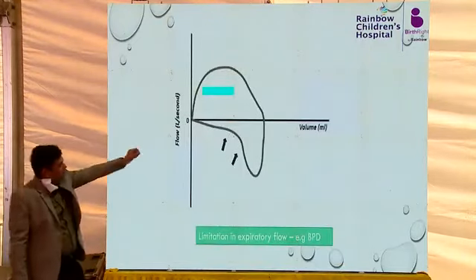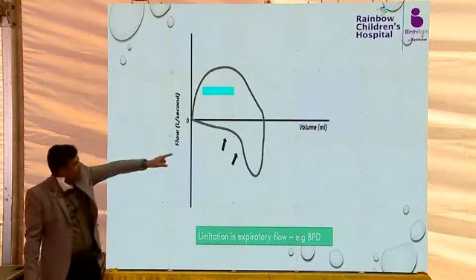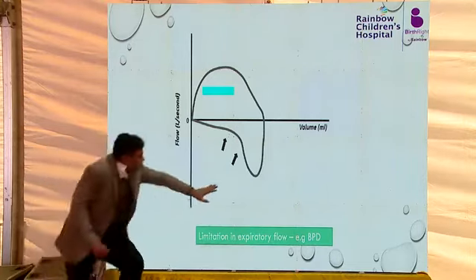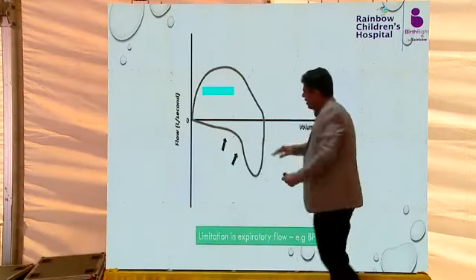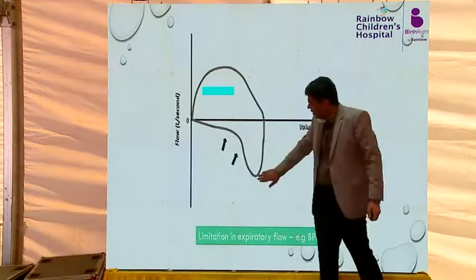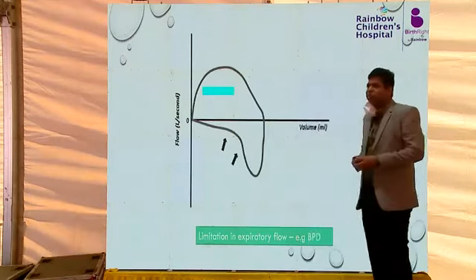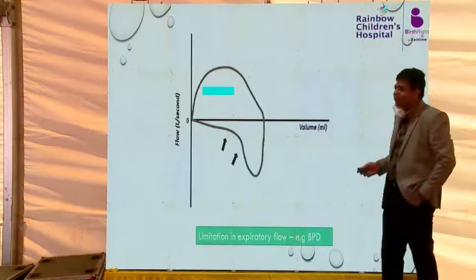So sometimes the upper one is the inspiratory, which is okay. In the expiratory part, the resistance is increased. In the expiratory part, the flow increases and then while returning to the baseline, it follows this curve, which is because of the increased resistance which is seen in BPD.